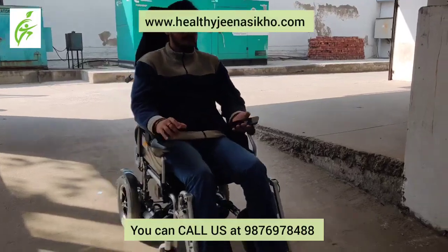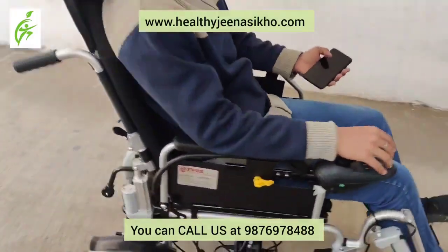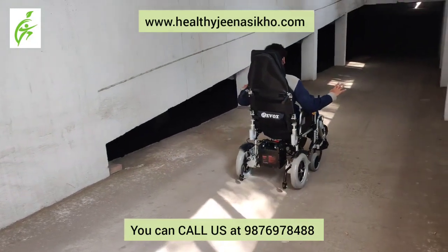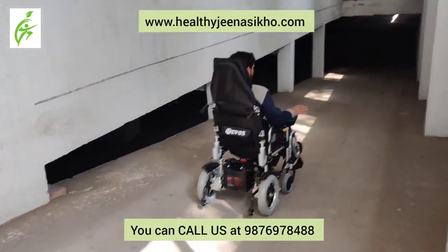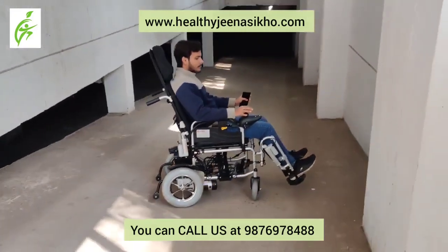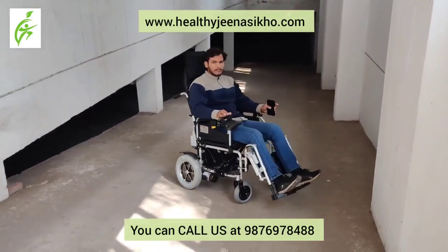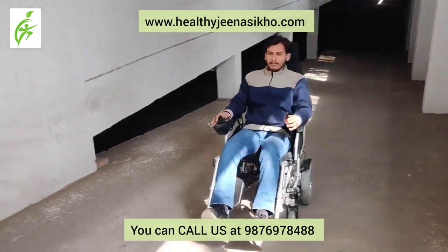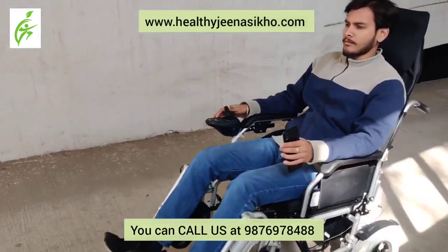There are brakes and there is no fear of slipping. As you can see, you can leave the wheelchair easily — it won't fall, it will stop if it slips. Then you can move on with the wheelchair. You can call us at 9876978488. Take care.